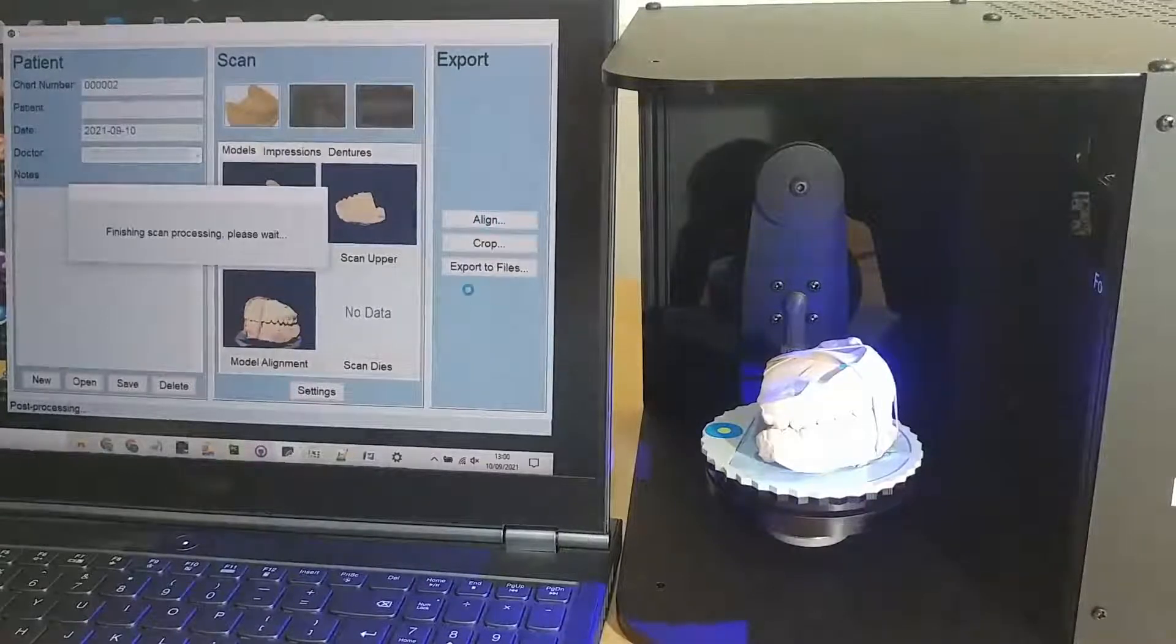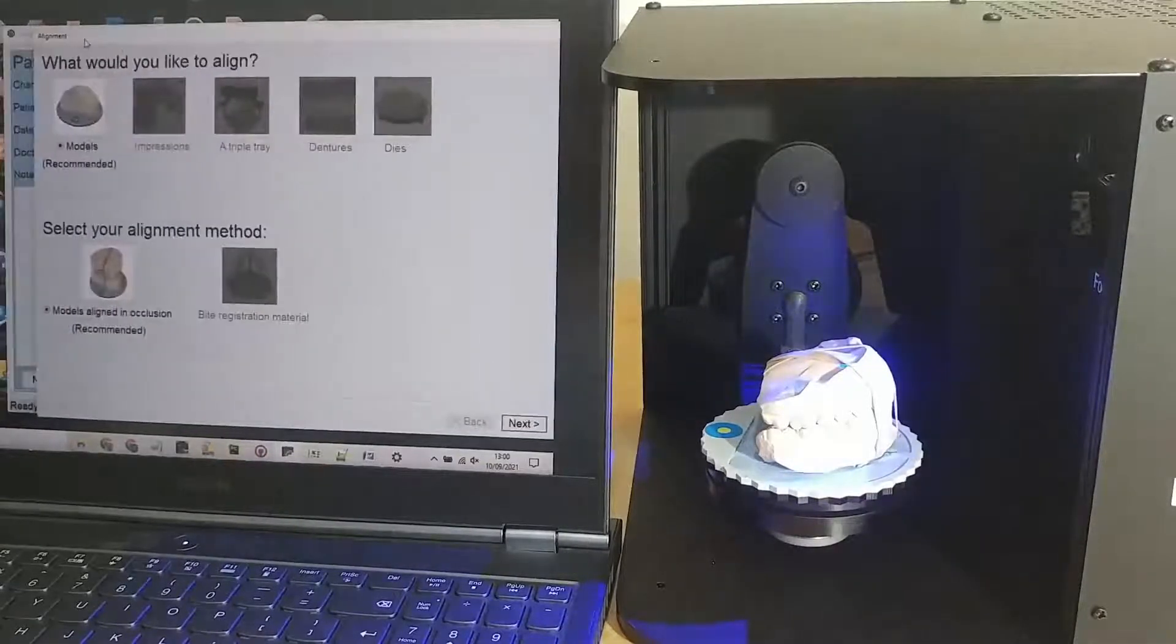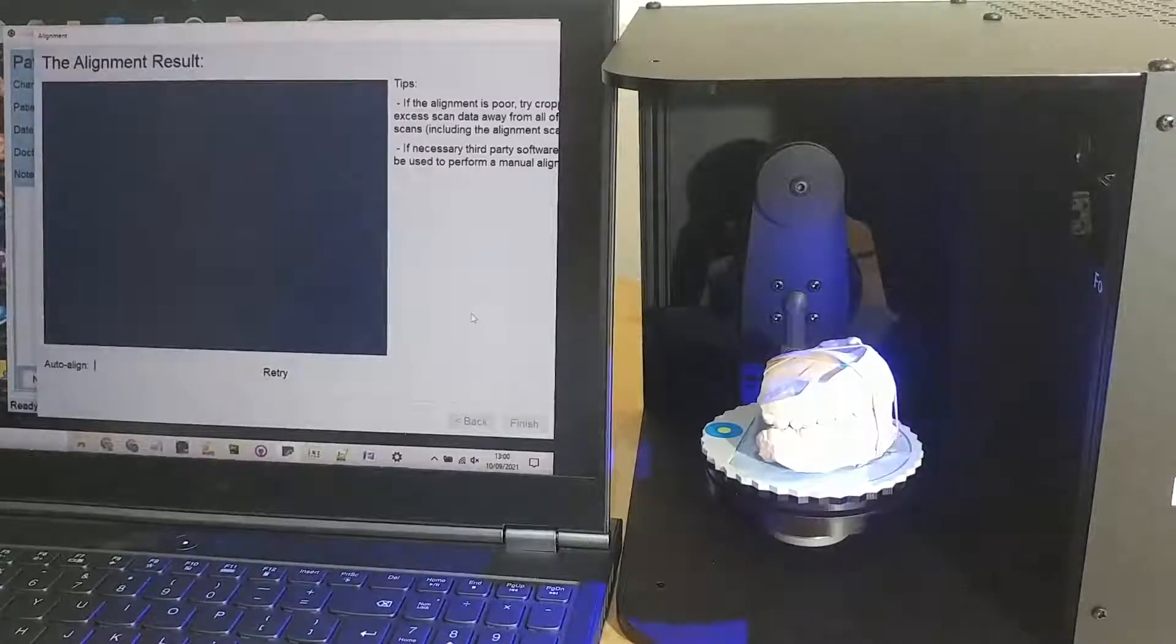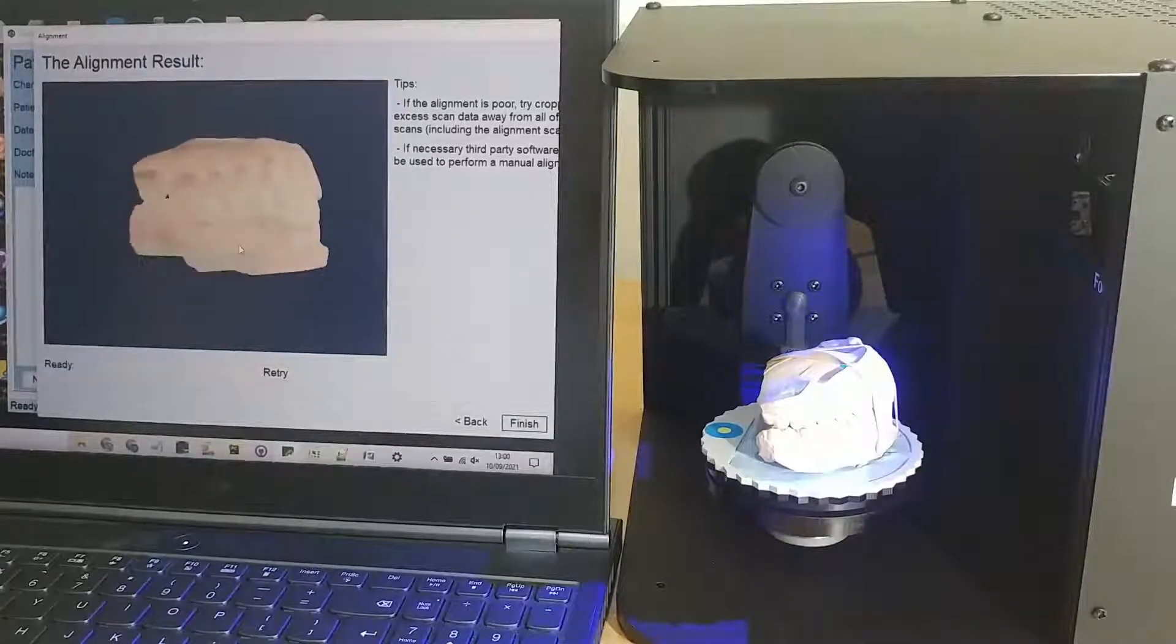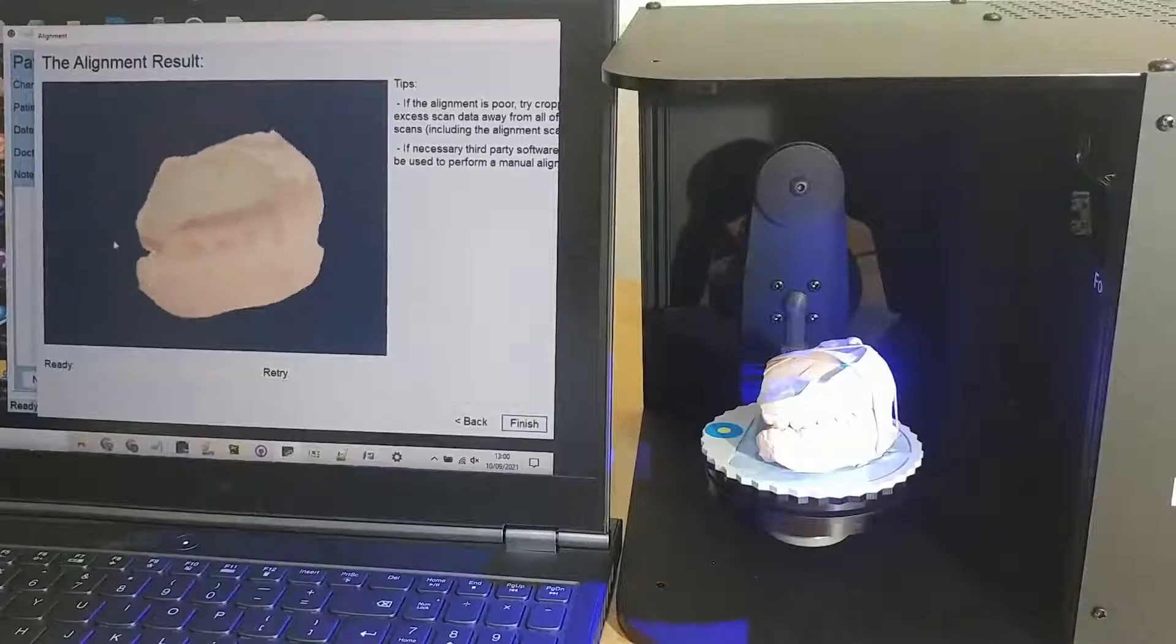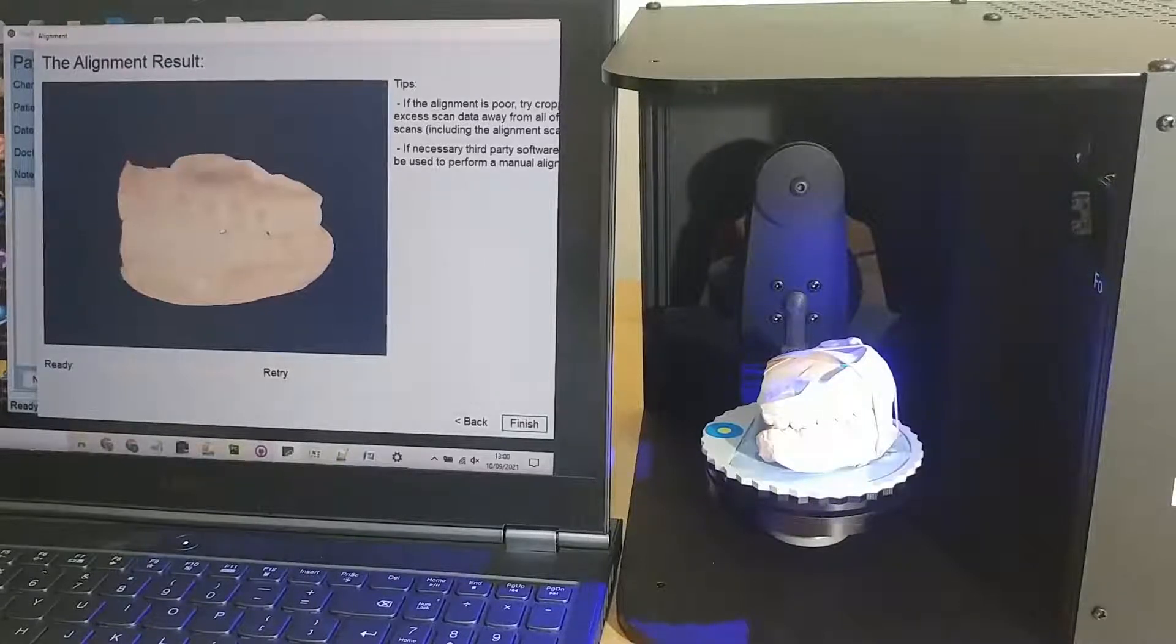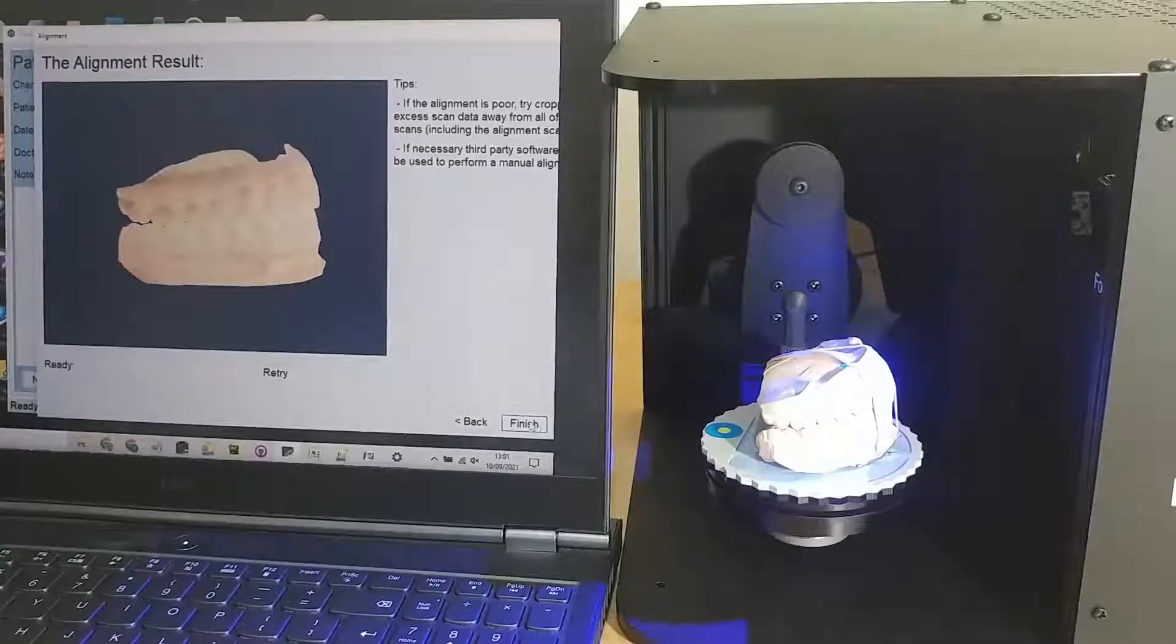We'd like to align models by using the rubber banded occlusion. So we click next. And then there is an incredibly powerful alignment algorithm that runs. And you can see it's successfully and completely automatically aligned the two high resolution scans in accordance with the alignment scan.